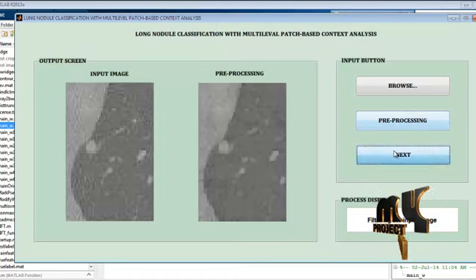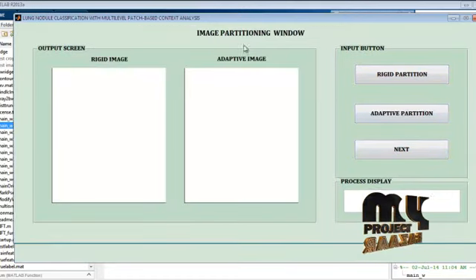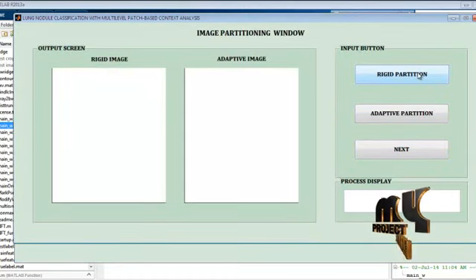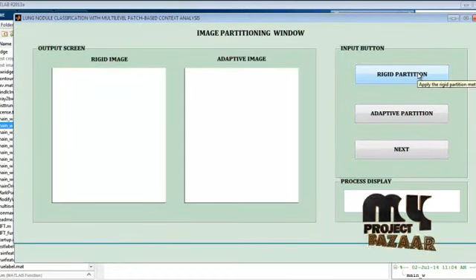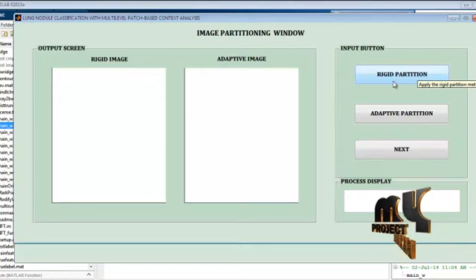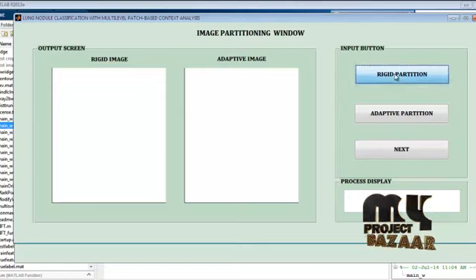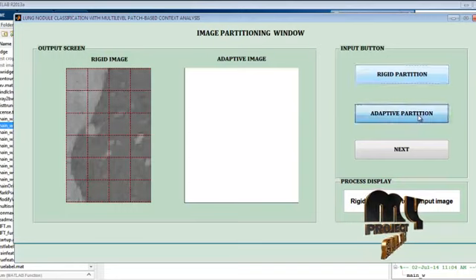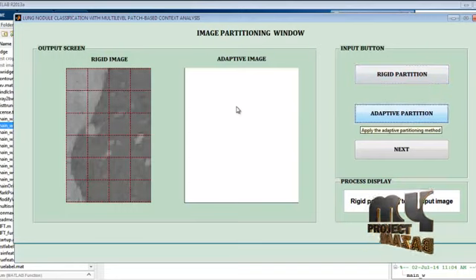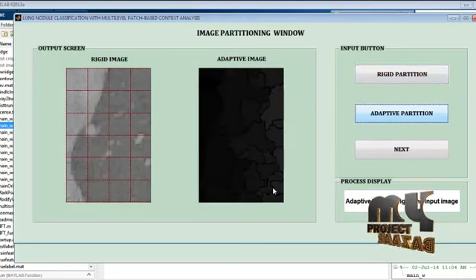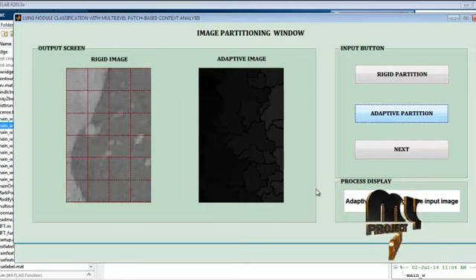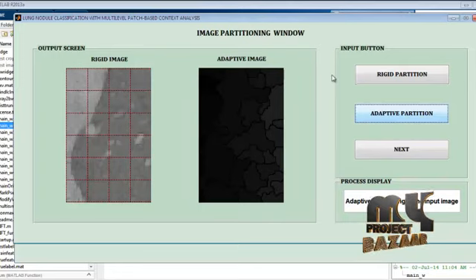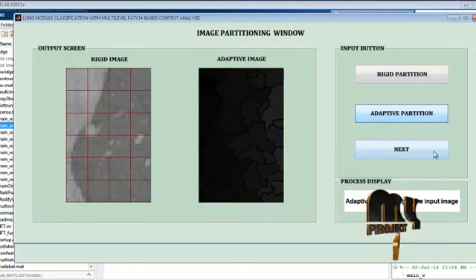Then go to the next window, which is the image partitioning window. There are two types of partitioning applied: the rigid partitioning method, and then the adaptive partitioning method, which is displayed and processed.